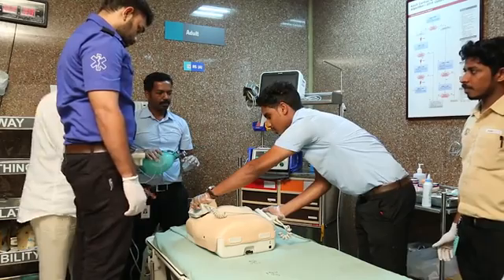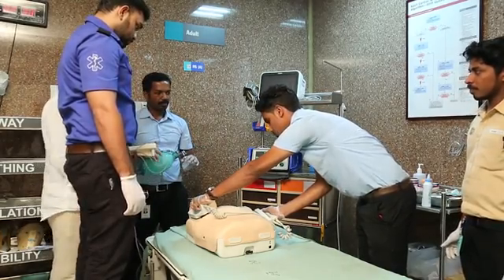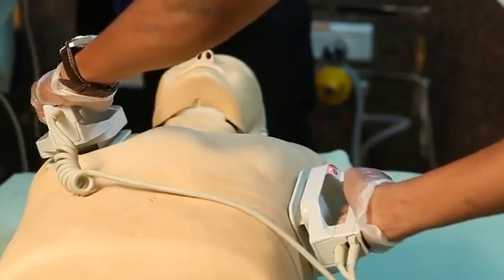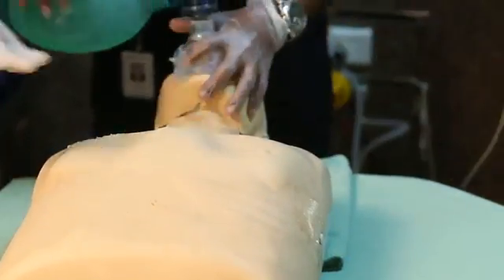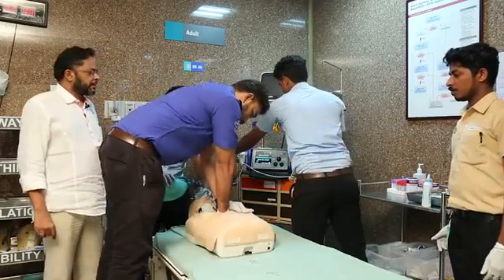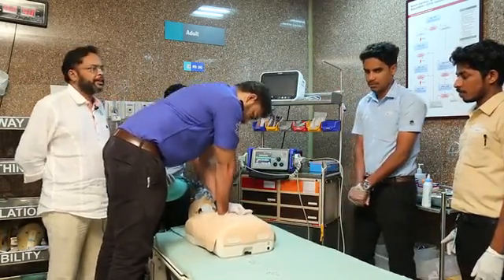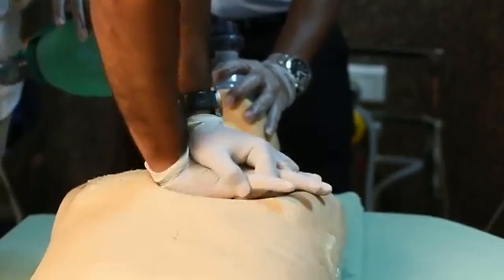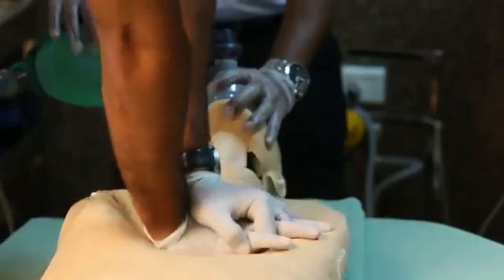Then discharge — press these two buttons together — and this will deliver 200 joules. Immediately after the discharge or defibrillation, effective and continuous uninterrupted CPR has to be restarted. This is the sequence.